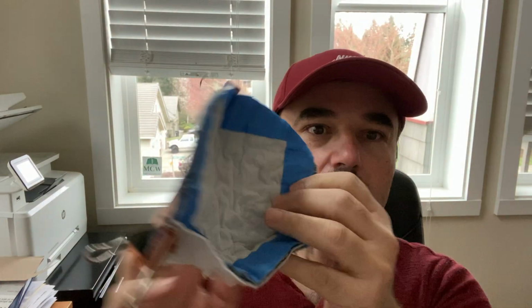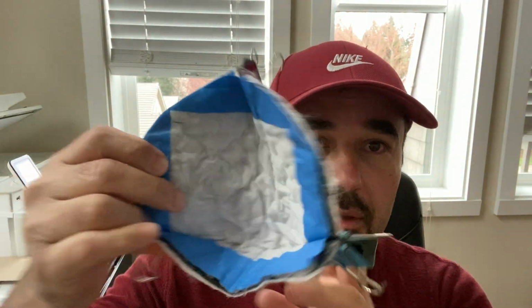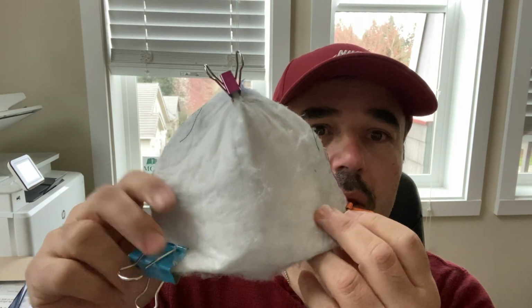Okay, again, here's kind of that dry fit. You want to make sure that it's sealing all the way around as well. All right, so the next step is, so now you have something that should look like this.